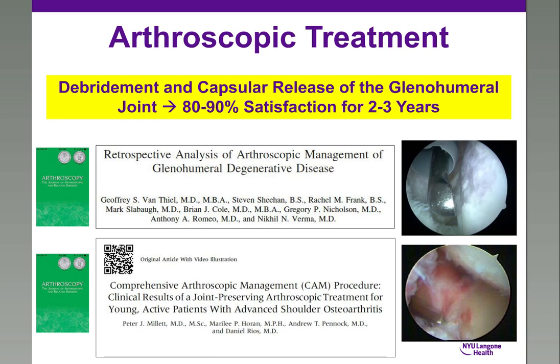And similar to what we had discussed, the outcomes that have been reported by these groups show really high satisfaction rates and improvements over preoperative baseline, but the efficacy and the benefit is relatively short-lived.